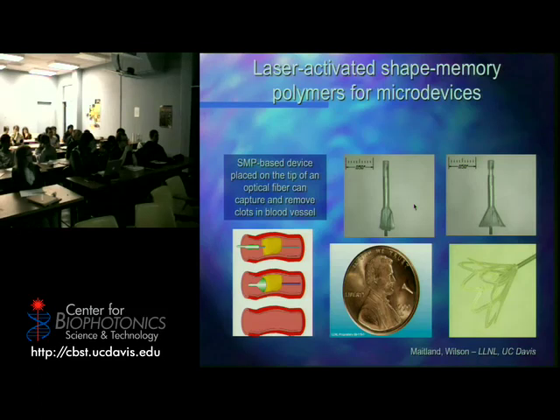But can you imagine, so I've got a bifurcation, here's my big artery and it splits into two and my clot's over here. And I punch through it, I grab it, I'm pulling it back. Now imagine the blood is still pumping, right? There's a lot of pressure going this way, right? A lot of pressure. But there's no pressure here because there's been no flow. I pull it back. What happens at this bifurcation?